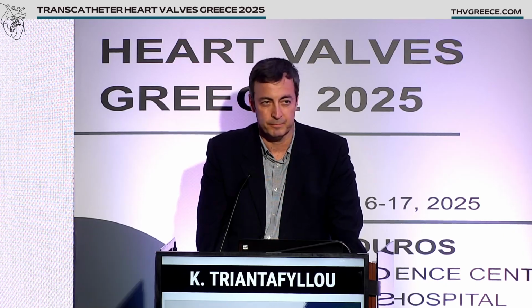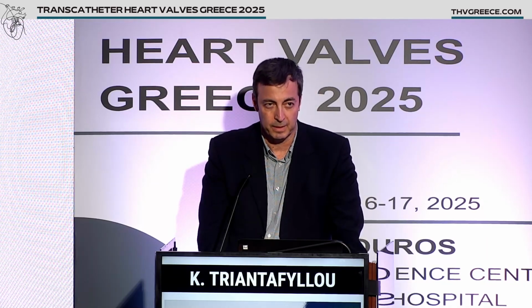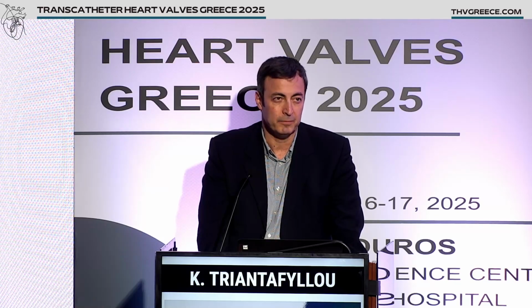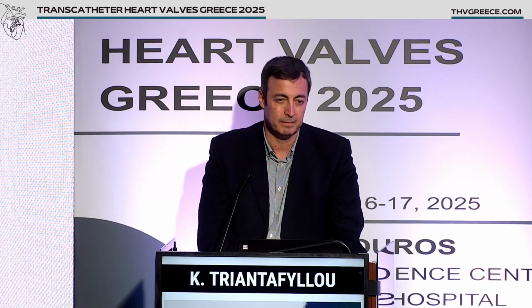Costa, another question is, in the case of a chimney or snorkeling and stenting, is re-intervention in the coronaries possible? It's a very tough question. For cases with self-expanding valves with a high frame, I think it's very, very difficult to imagine how you will manage to do it. I think there is a case of re-intervention after chimney, but in a case with a low frame, and I think it's Adam Taleb that had described it, with the title "Going Down the Chimney." I have seen it, so it's possible, but under specific circumstances that make it technically possible.